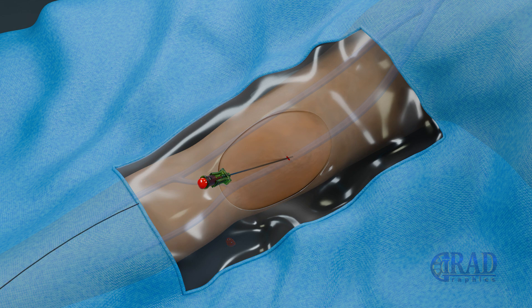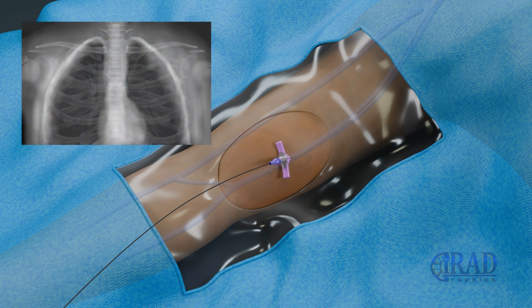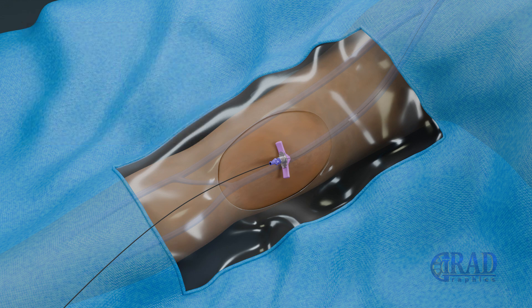A microwire is advanced through the needle into the vein and the tip is positioned appropriately under fluoroscopic guidance. Next, the needle is exchanged for a peel-away sheath and the microwire is advanced under fluoroscopic guidance until the tip is placed at the cavoatrial junction, to measure the endovascular length after trimming the catheter to the appropriate endovascular length.